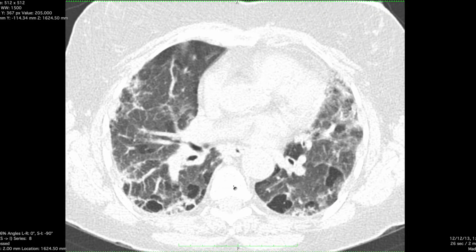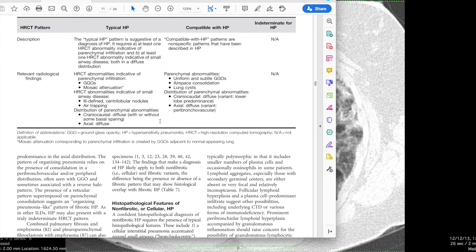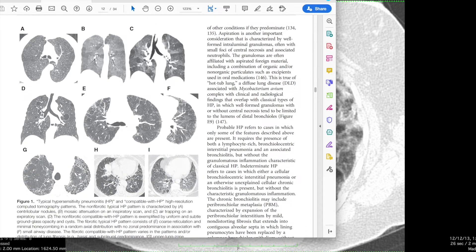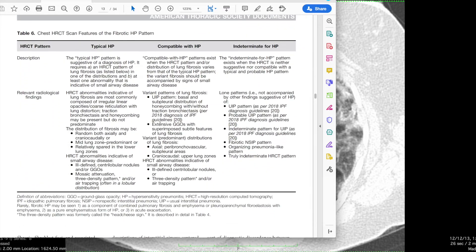This combination of air trapping superimposed on pulmonary fibrosis is suggestive of hypersensitivity pneumonitis. I'll draw your attention to the recent guidelines paper on hypersensitivity pneumonitis, which obviously includes a radiology CT section.